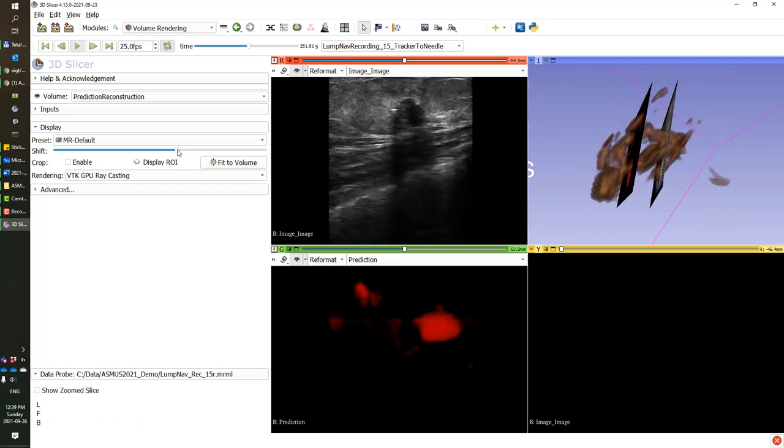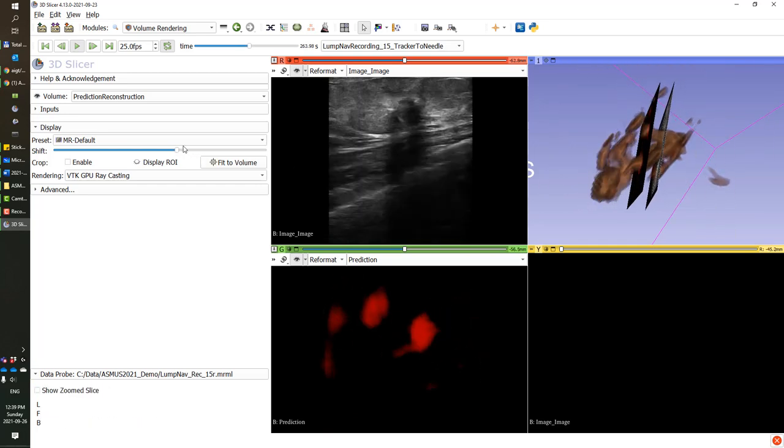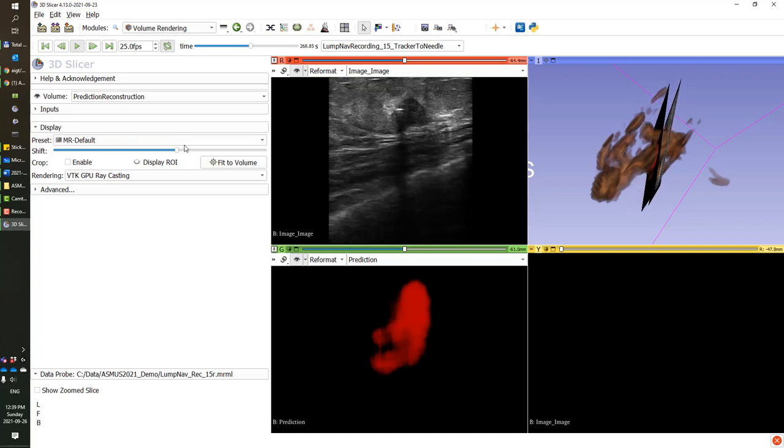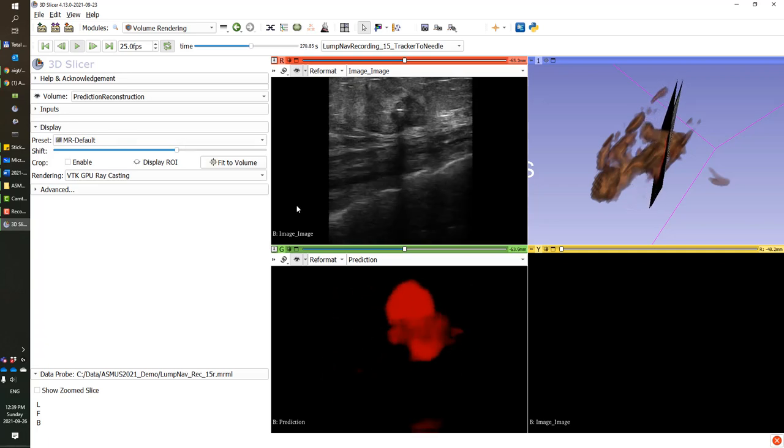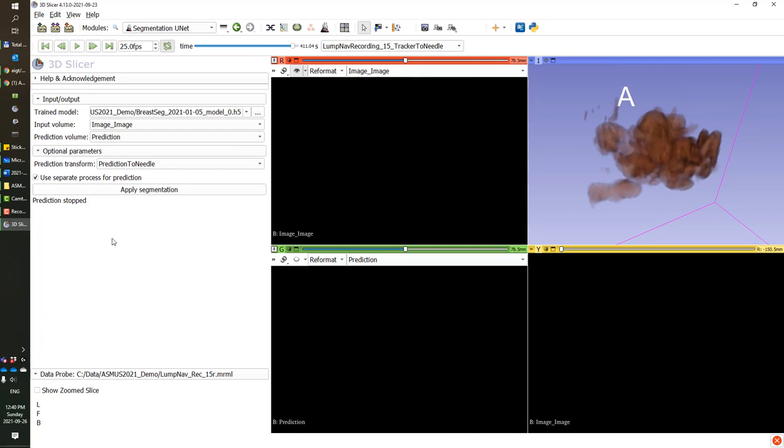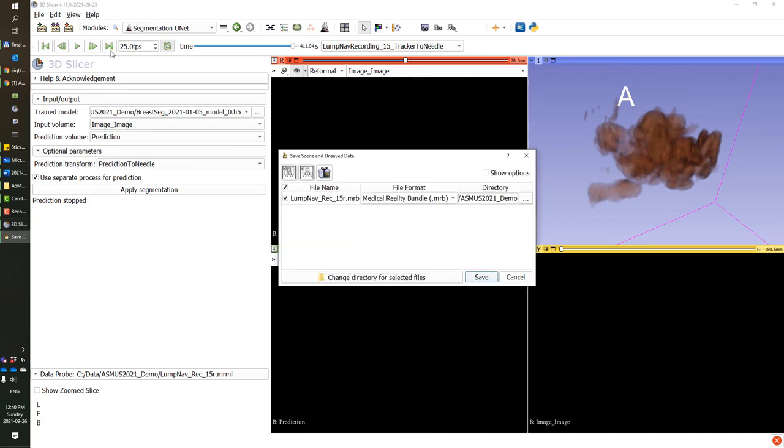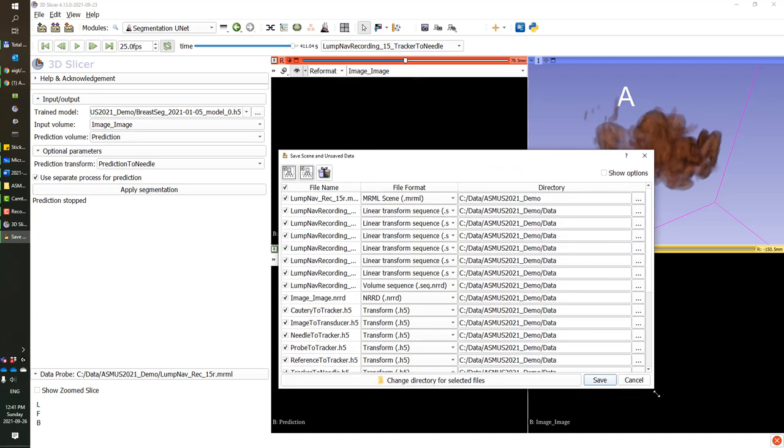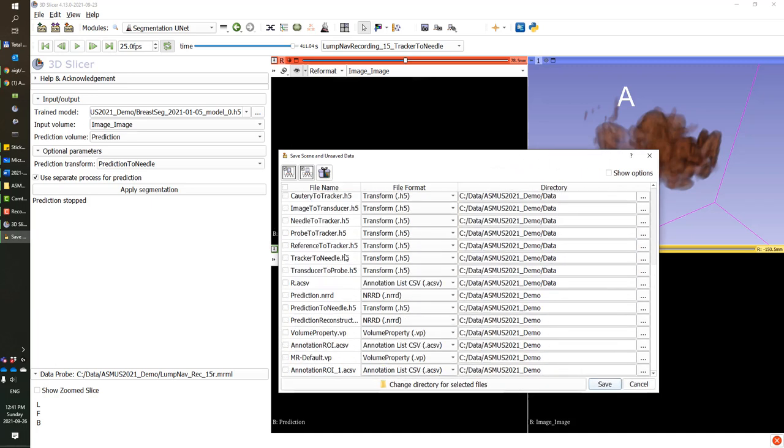So if we let the scan run down and produce the complete tumor volume, then we can save it. And as the final part of the demo, I'd like to show how you would apply this information in a surgical navigation module in Slicer.